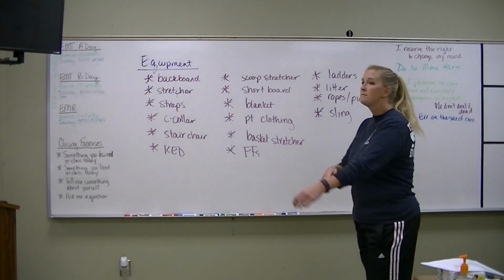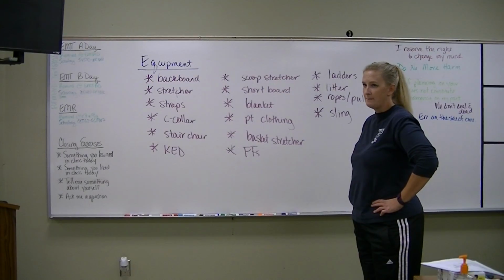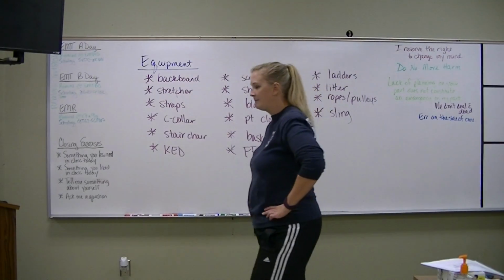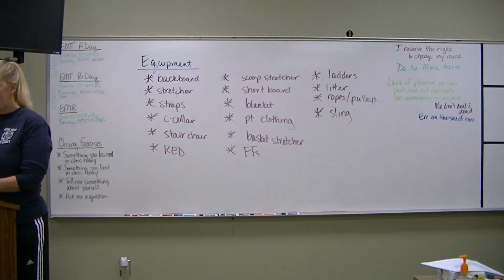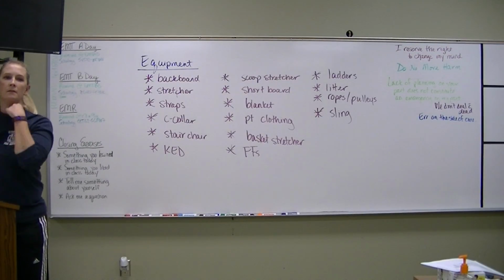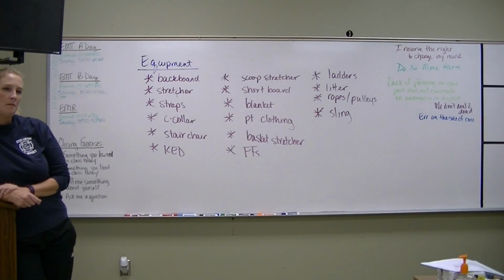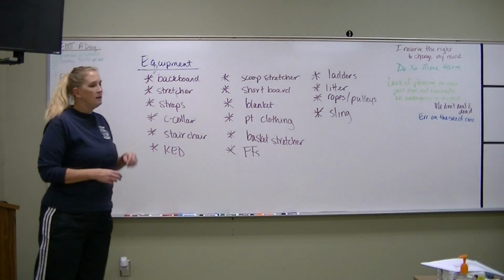Okay. Well, every time you put a patient on board your ambulance, regardless of where they're at, they're supposed to be belted down. So yeah, straps do play an integral part. And you always end up putting the person on the stretcher and putting straps on them there because that is their seatbelt. They may not get transported. If you take them and they refuse transport, they might not necessarily end up on the stretcher, like you're getting them out of somewhere. That is possible.